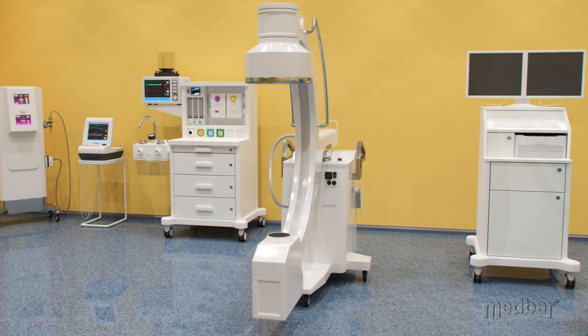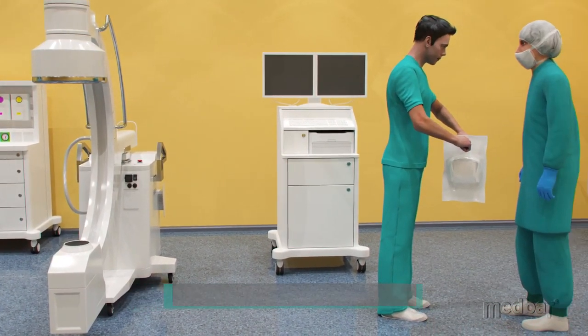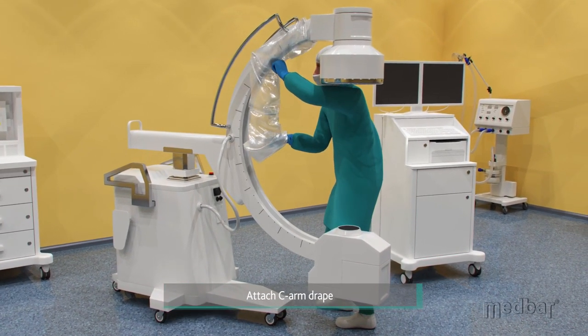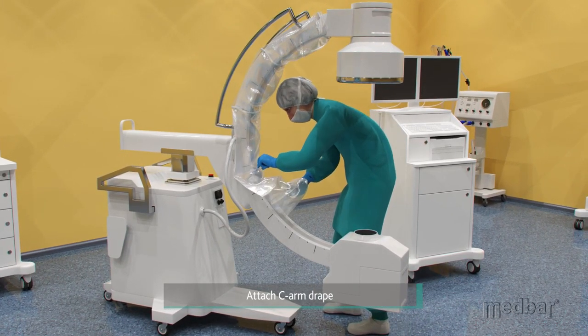Covering the C-Arm machine with the Medbar Drapes Pack is simple. First, with the help of an assistant, the nurse will pull the drapes out of the sterilized pouch. Next, they will apply the C-Arm Drape over the arm by pushing each clip until they are securely fastened to the machine.